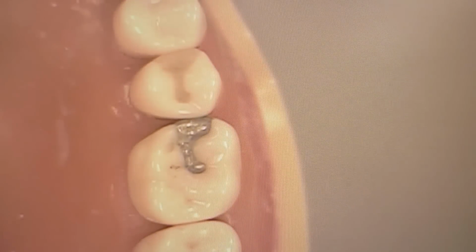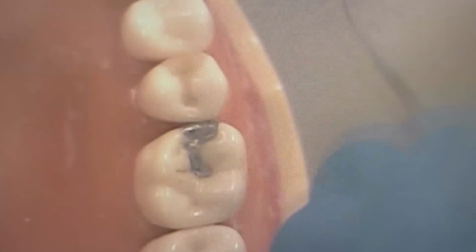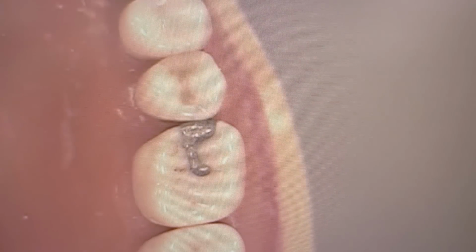The margins look sealed. Checking it out. Sealed. That's it. All right, you go over how to finish it? Sure.